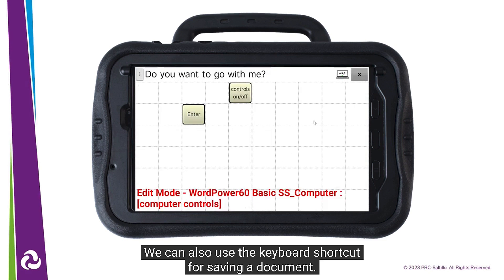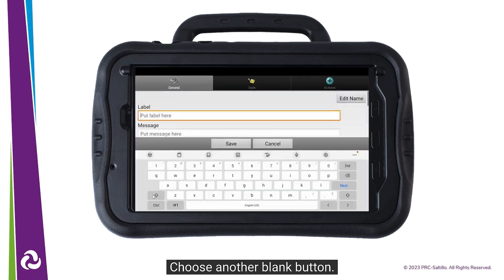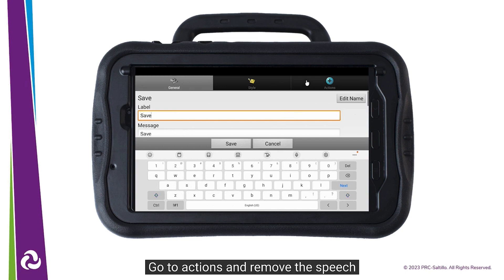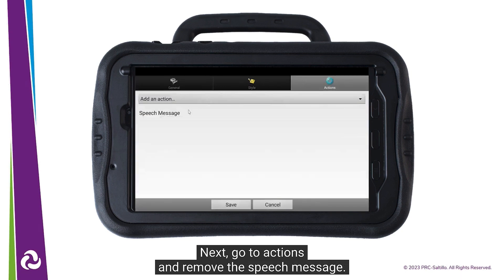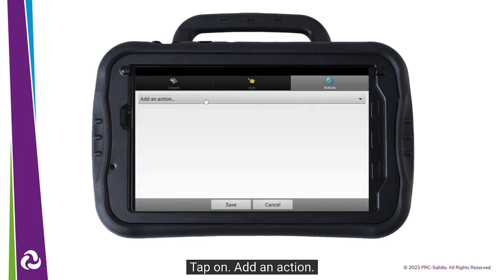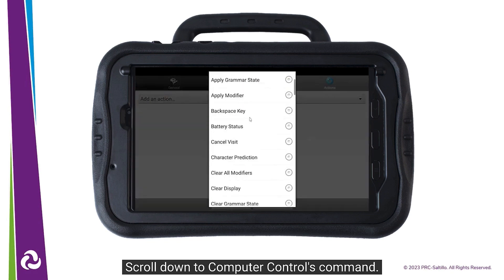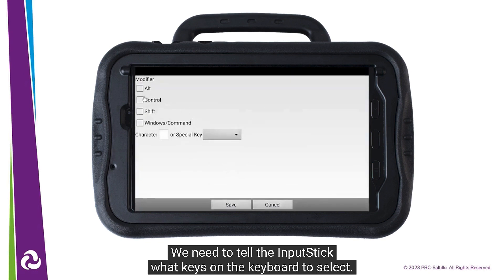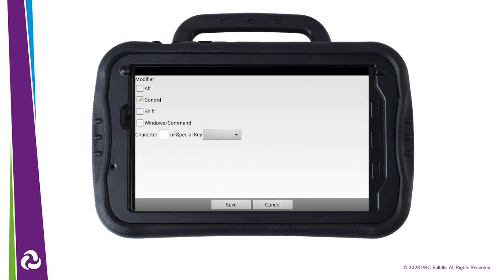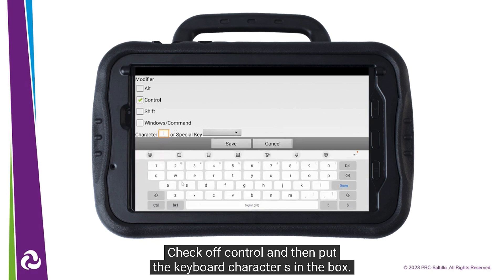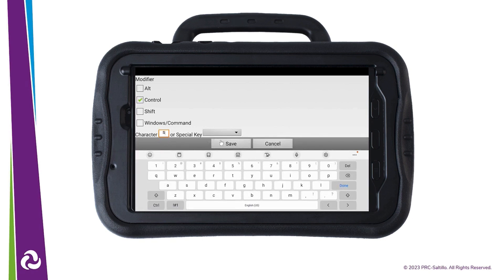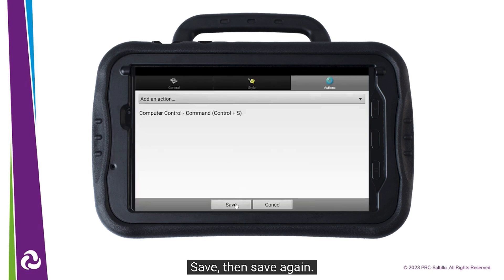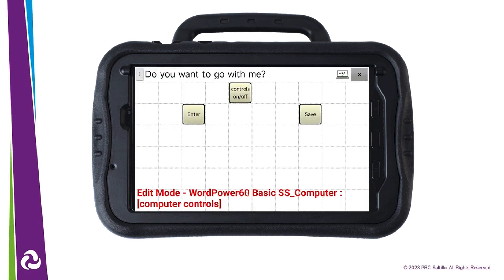We can also use the keyboard shortcut for saving a document. Choose another blank button and give it a label. Go to Actions and remove the speech message action. Tap on Add an Action and scroll down to Computer Controls Command. We need to tell the input stick what keys on the keyboard to select — check off Control and then put the keyboard character S in the box. Tap on Save, then Save again. Exit Edit Mode.